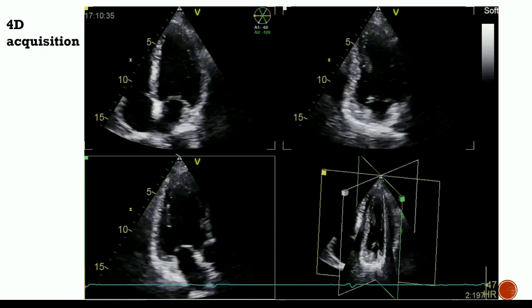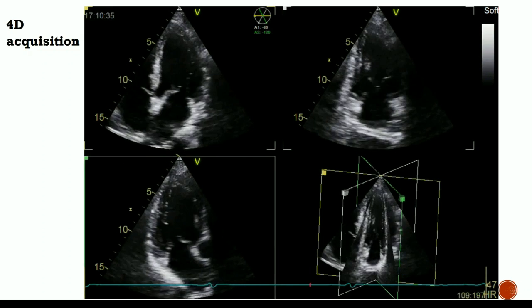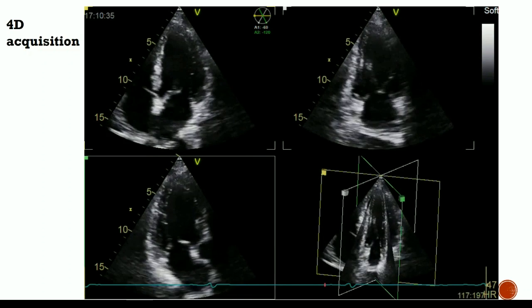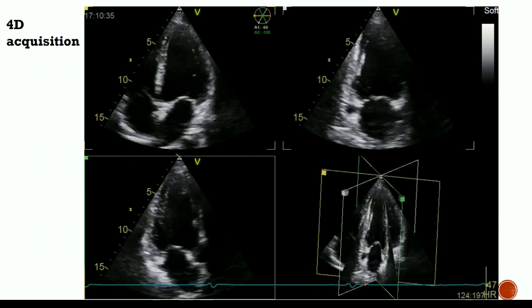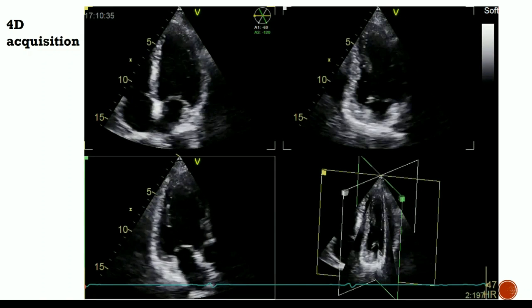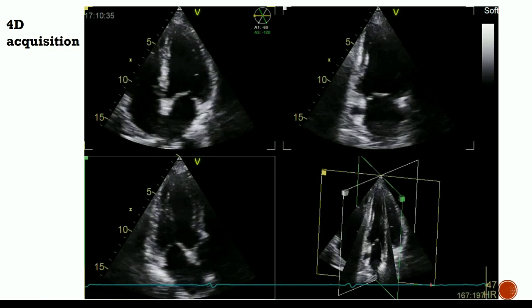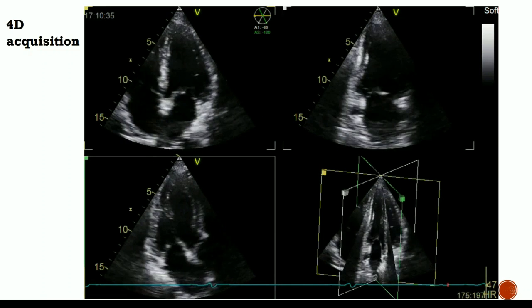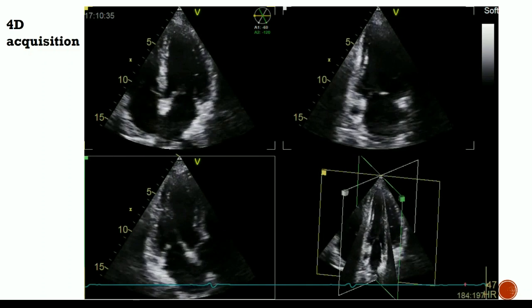I think one of the big takeaways here is that if you're going to do strain, measuring serial strain over time in the same patient should probably be done with the same vendor package on the same echo machine. There's probably more utility, if you're seeing a patient in follow-up, in making sure the scan is done at the same place. It's probably important to bring them into your clinic, where you have your machine and know the typical normals, as opposed to the patient going to multiple different places to get follow-up echoes. Because I think that's the biggest problem.